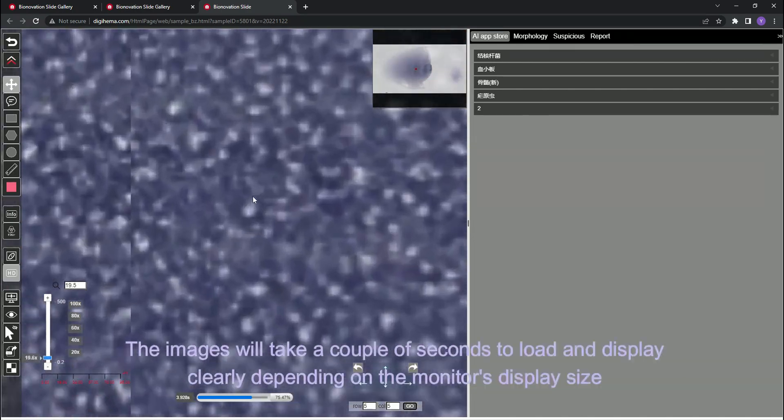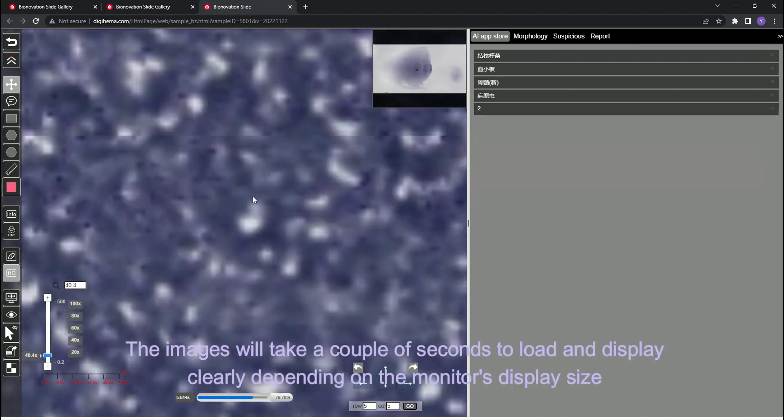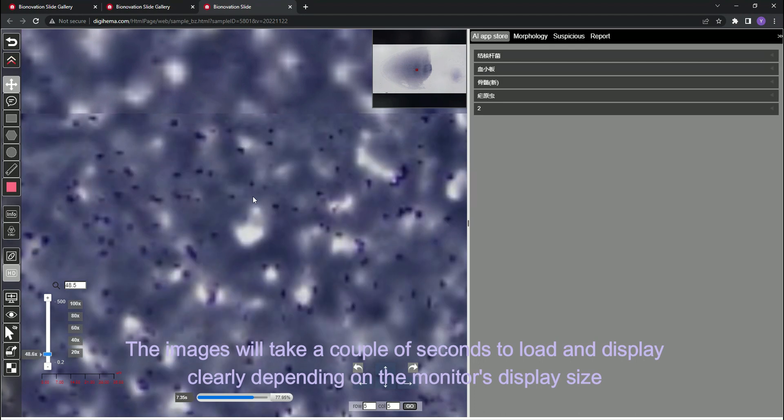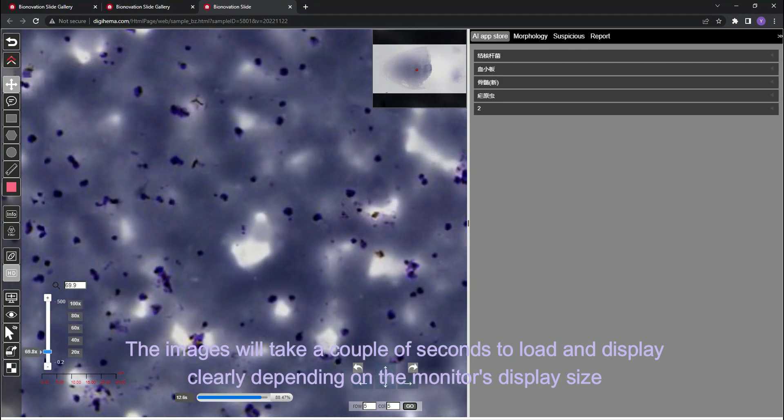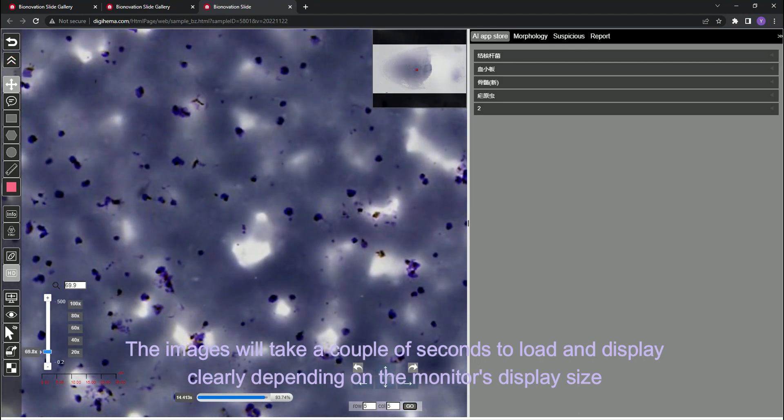The images will take a couple of seconds to load and display clearly depending on the monitor's display size.